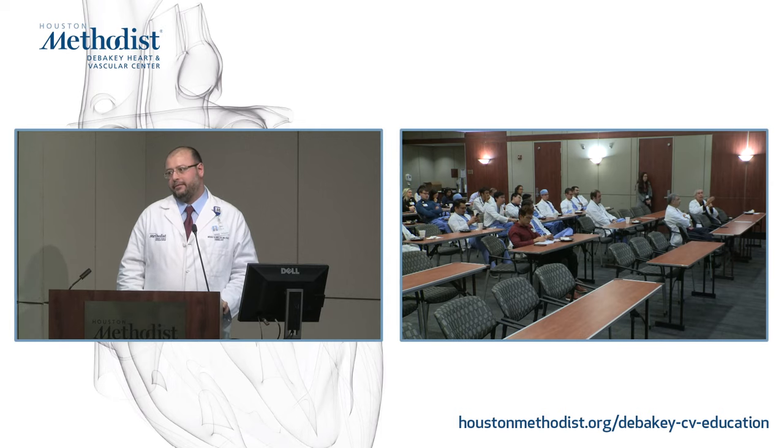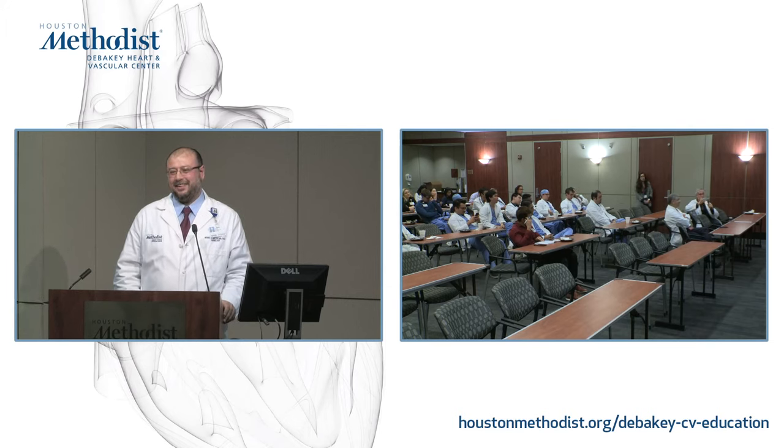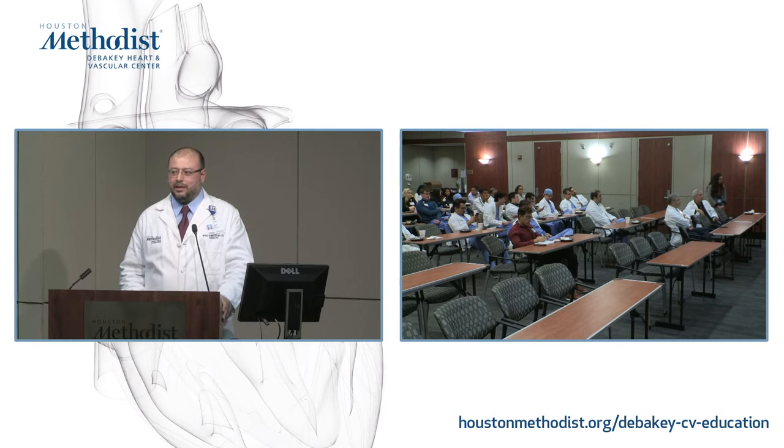But remember that intrinsically, rubidium, for instance, has intrinsic problems with resolution because it annihilates away from where it originates. We're going to come to that. So this all becomes part of the issue, right? Yeah, we will come to that. But the bottom line is we have good accuracy overall for the amount of radiation we're giving the patient. The newer system has much less data, and this is the type of data we're trying to generate.